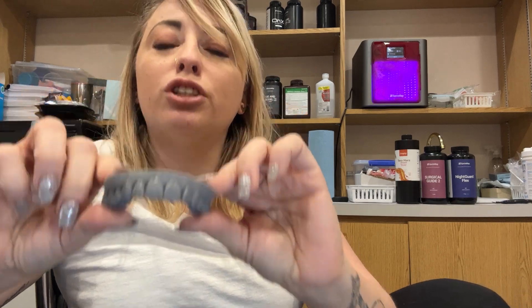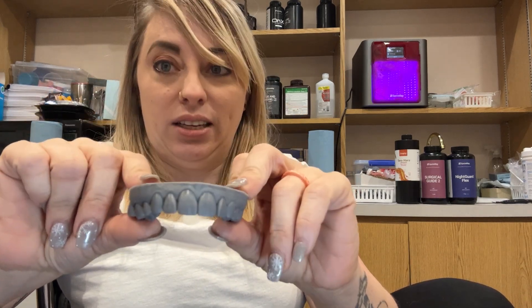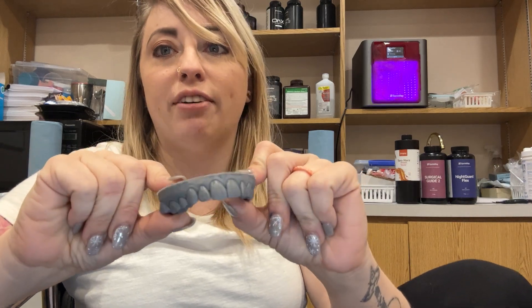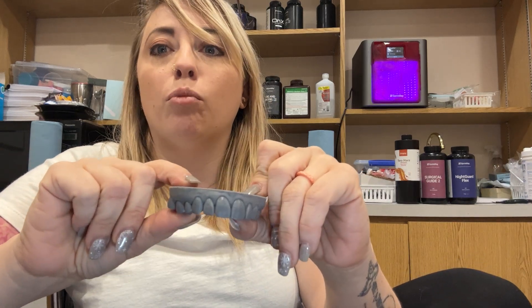This was actually for our hygienist Lena, so these are her beautiful teeth. We 3D print these, then show it to the patient. The patient says it looks great, they love it. Our hygienist Lena wanted some veneers.